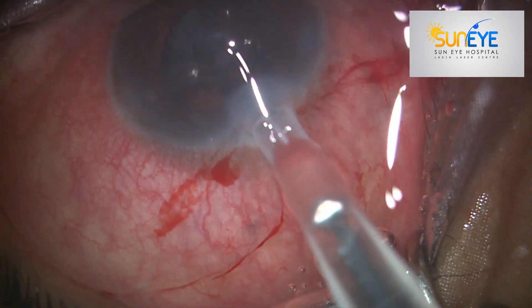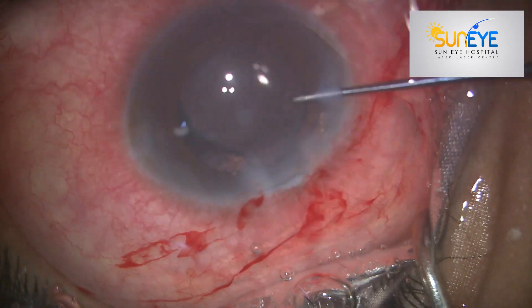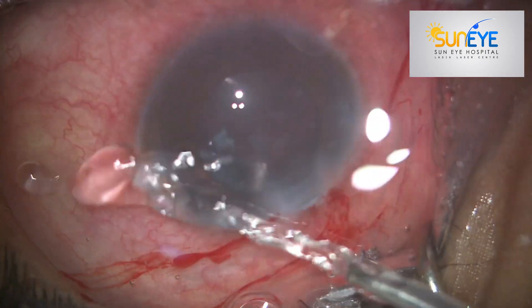The eye is now ready for implantation. Thank you very much for watching.